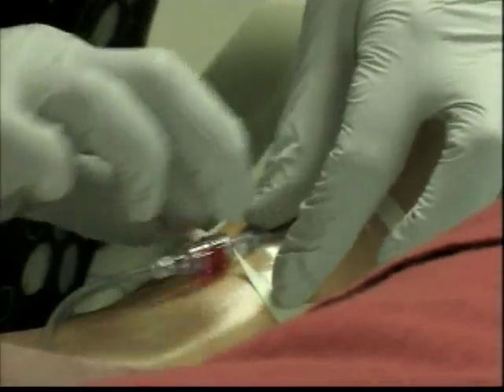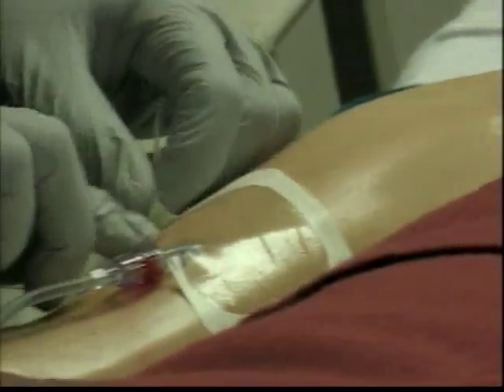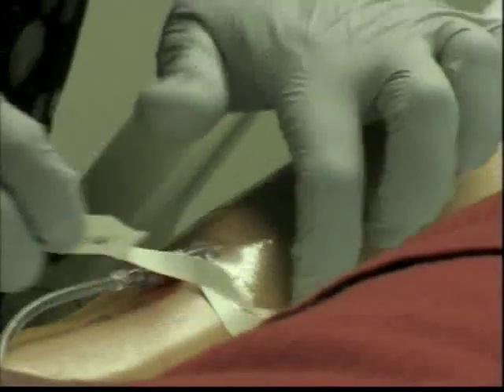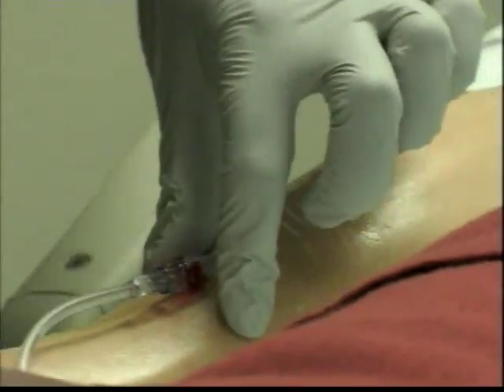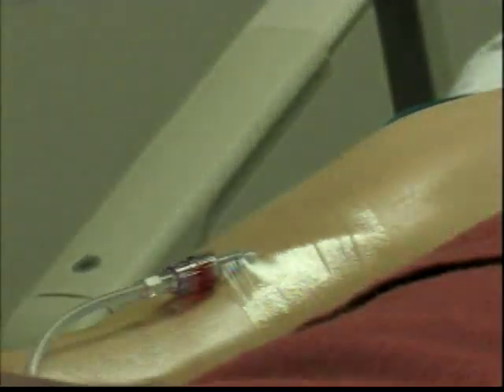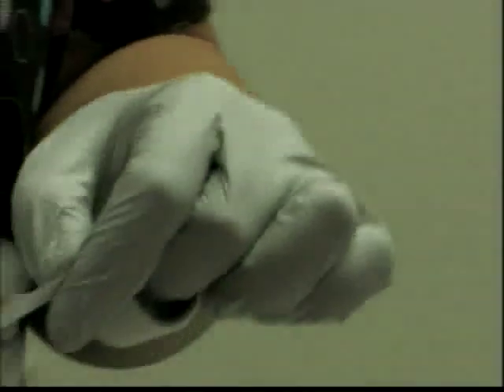You're going to remove and save that part because you have the number in here for the date and the time. Okay. At this point, then you're going to have your tape, and you want to get enough piece that will create a U, something about this long. You cut it, you get 2. See how I did it?